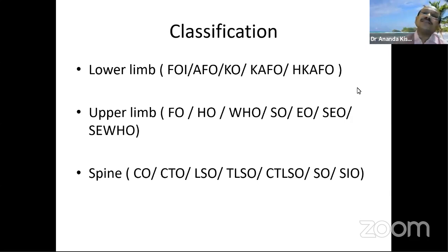On the other hand, if the disease involves both the ankle and the foot, we have to extend above the ankle. In that case, the orthosis of choice is the ankle foot orthosis. If the disease is confined only to the knee, for example osteoarthrosis of the knee, we encompass only the knee joint, and the orthosis of choice is the knee orthosis. If both the knee, ankle and foot are affected, we have to encompass all three joints, and the orthosis of choice is the knee ankle foot orthosis. Similarly, hip knee ankle foot orthosis can be used in severely paralyzed monoplegia.